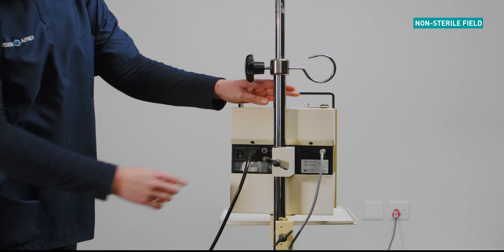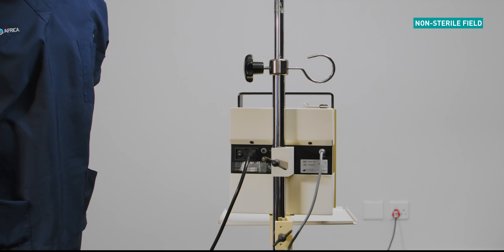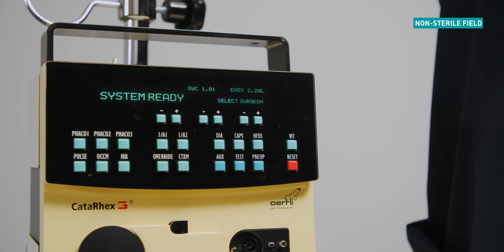Select the on/off switch situated at the back of the machine to power on. If the startup function has been completed successfully, the system ready message will be displayed.